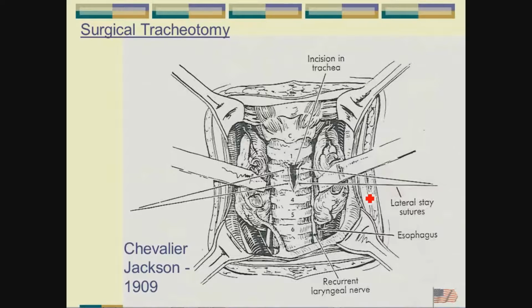This gives you the impression that it's a huge amount of neck, but it's a relatively small incision, maybe 3 inches long, that is then dilated by pulling back on the skin, which is what they're showing there with the retractors. Is that the proper term there, Ken? Okay, good. 3 inches or 3 centimeters? It's about that long. Maybe I'm exaggerating there.